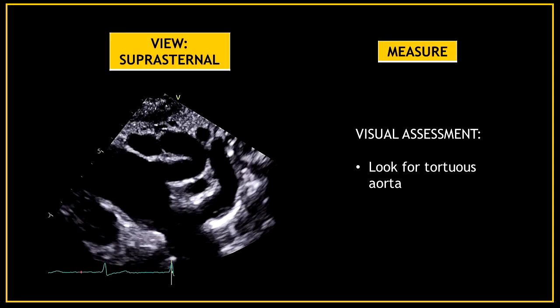And to finalize, it's very important to look at the aortic arch branches during the visual assessment, as you can encounter something like this — an example of a tortuous aorta.